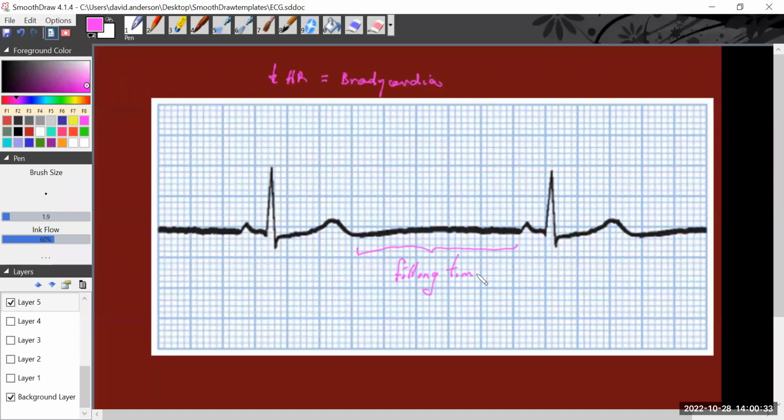So the first 2 ECGs that we've looked at do not necessarily represent any kind of pathology. If there's a clinical picture that reflects the possibility and then we add the ECG to the equation, maybe it does. But this may just be a very fit individual who has a resting heart rate closer to 40 or 50 rather than between 60 and 90.